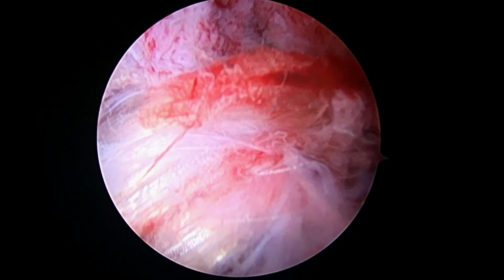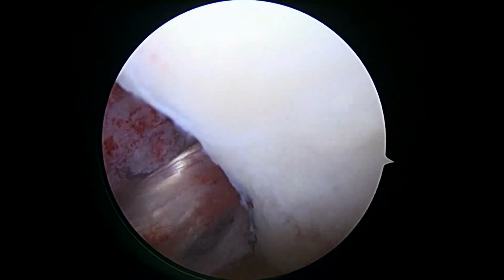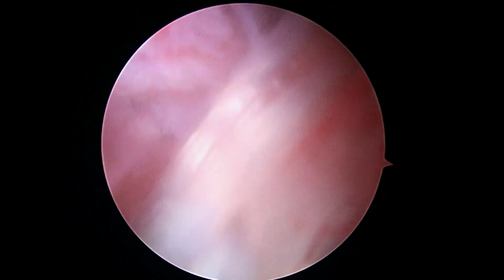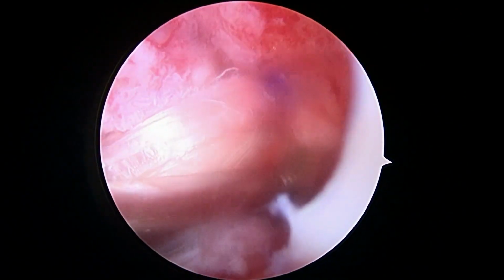Okay, so here's the graft in position. I like the way that looks. We've ranged it. We're ranging it again. And it tucks back. It's a little hard to see the Biobrace. Sorry, we're going to get the knee flexed up. Help me flex the knee. There's one strand of the Biobrace you can see there. But it already looks like it's starting to absorb some of the fluid, and that looks good. So now we're going to work on the medial side, and then we'll be done.